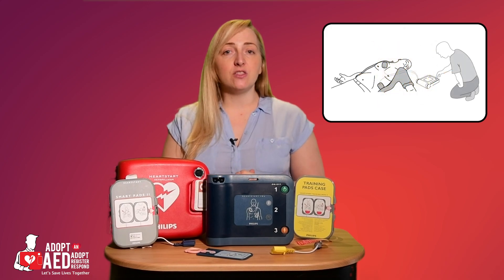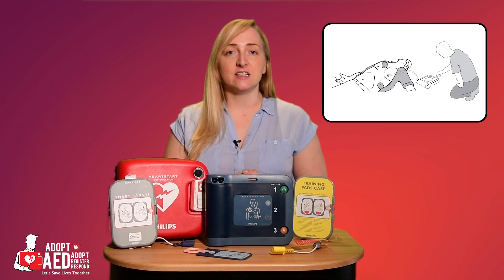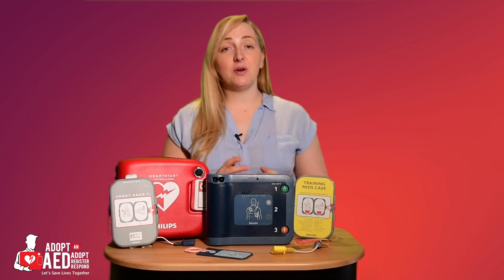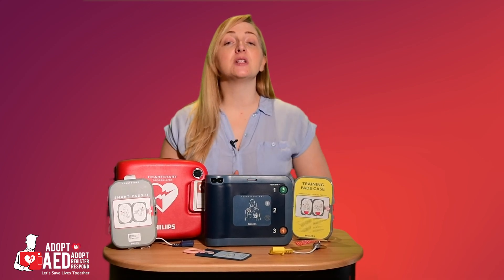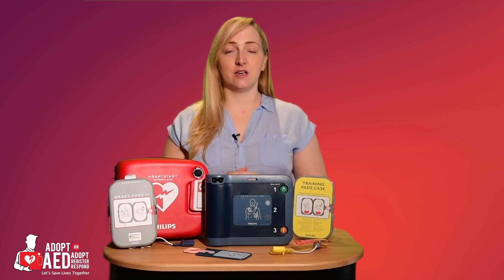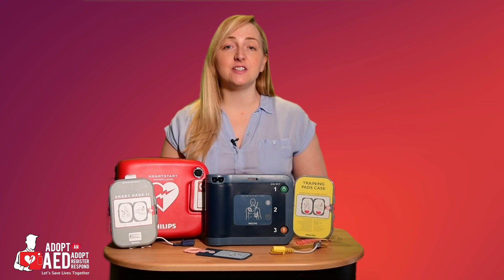Like the HS1, the voice command will repeat and rephrase if additional help is needed. If you are in a noisy environment, the relevant icons will flash. To activate the AED, all you need to do is push the green button and the voice commands will guide you through the entire process, from placing the pads on the patient to performing CPR and delivering a shock. It even guides you on the frequency and depth of chest compressions, as well as the rescue breaths.